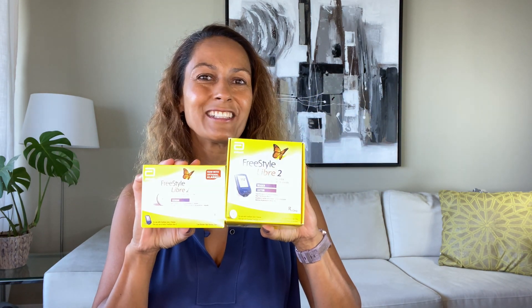I am Christelle from Diabetes Strong and I got my hands on a Libre 2 reader or receiver and a Libre 2 sensor, so I thought let me do a Libre 2 review. Before we talk more about what the Libre 2 is and how it can support your diabetes management, let me just get the sensor on and the system up and running.